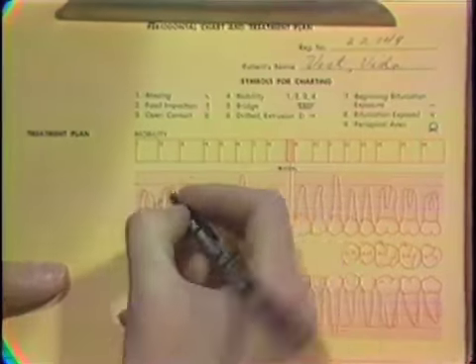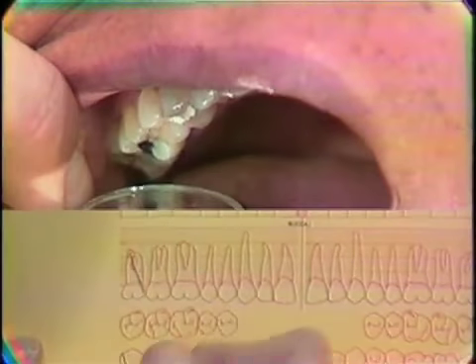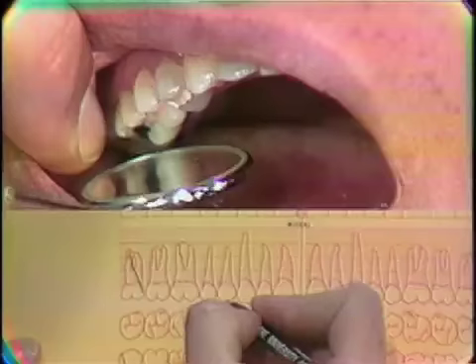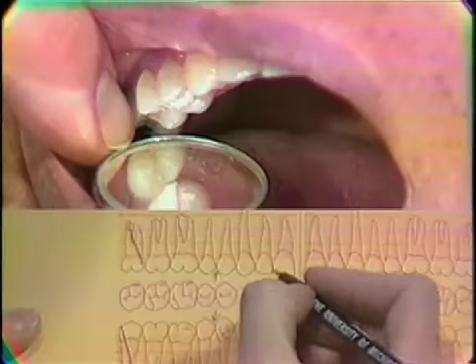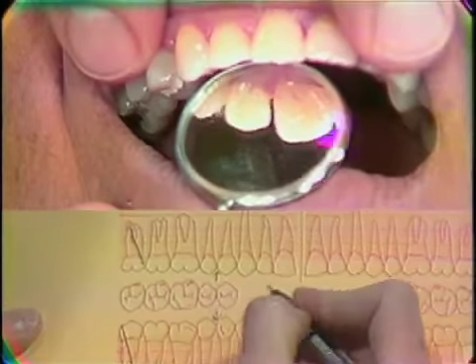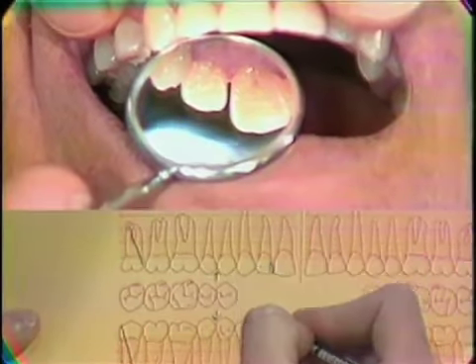Missing teeth? Tooth number 1 is missing. Food impaction? There is food impaction between tooth number 4 and tooth number 5. Open contact? There's an open contact between tooth number 8 and tooth number 7. Mobility?